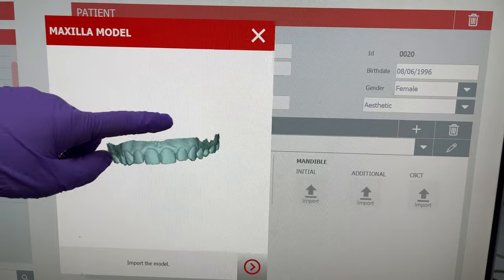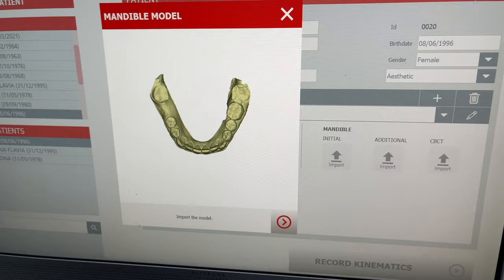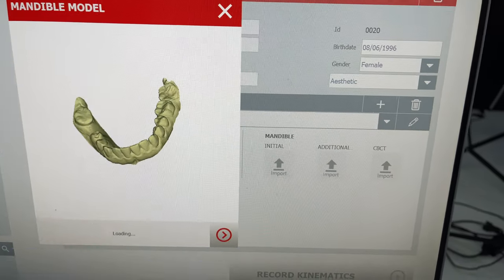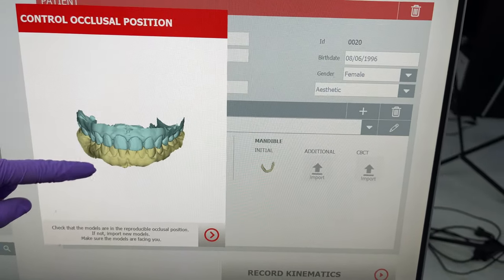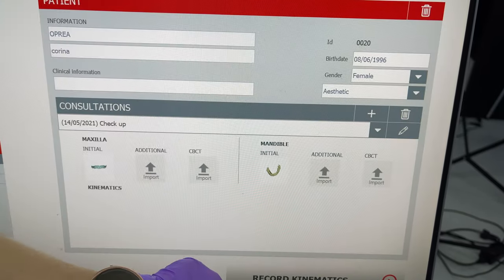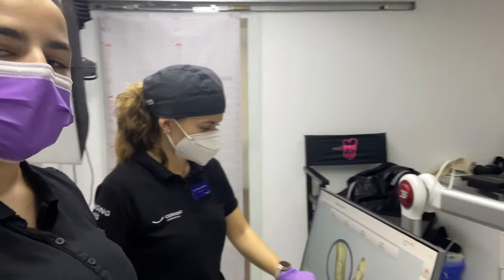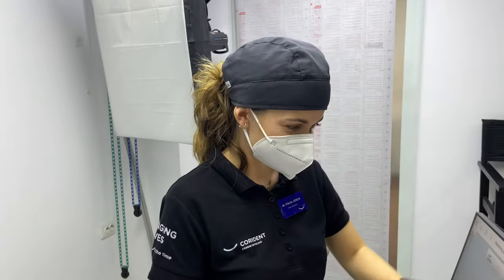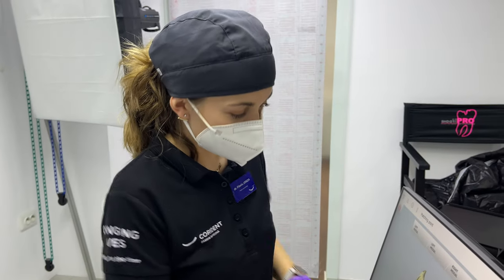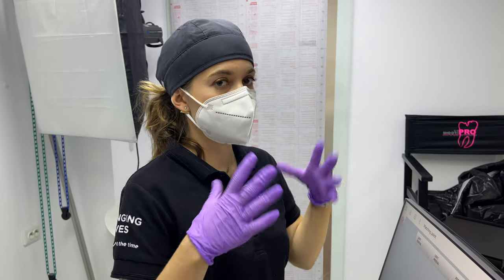We check the model. We can check the occlusion and see if the models are okay and everything's okay. At this stage, we have to draw some guidelines. I'm going to show you. Why do we draw guidelines? We need these guidelines so we can calibrate Corina's jaw movements with the camera.